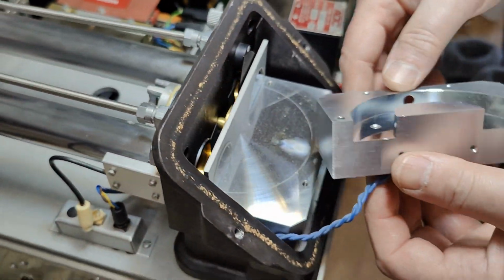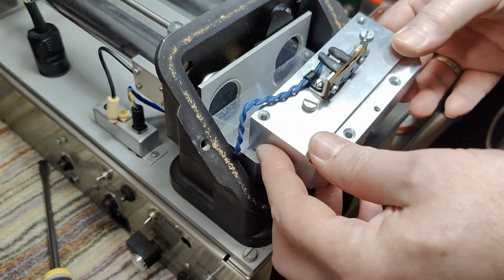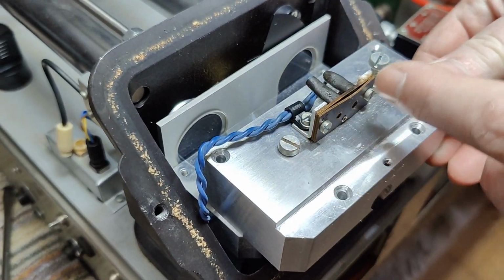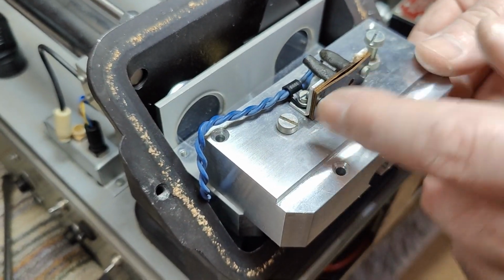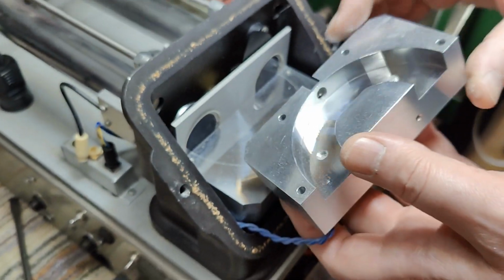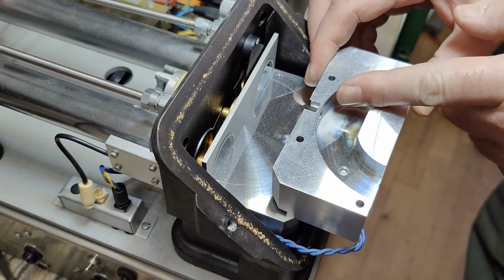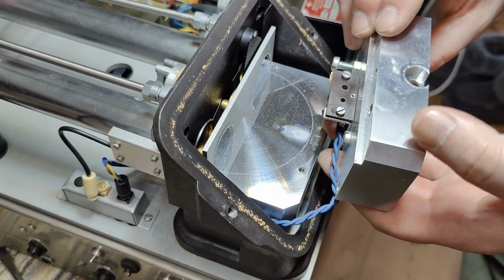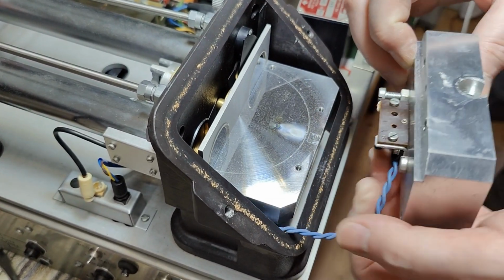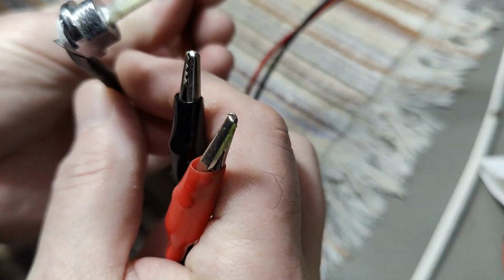And this is all nice and shiny and reflective, and this is how it was mounted. See, there's actually a calibration screw here, so you can fine adjust the two halves, so you are super sure that you get exactly the same amount of infrared in both of the sides. Yeah, I'm definitely going to test if there's anything working here. Let's try and play with this thing.